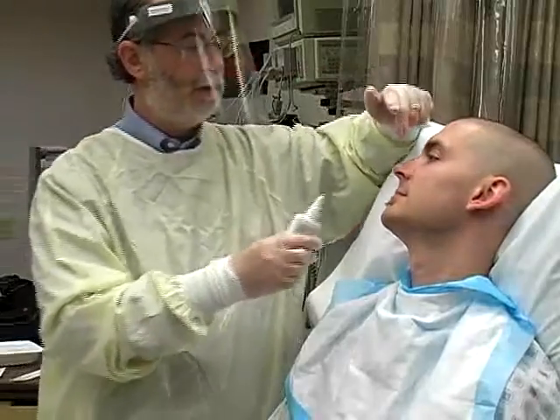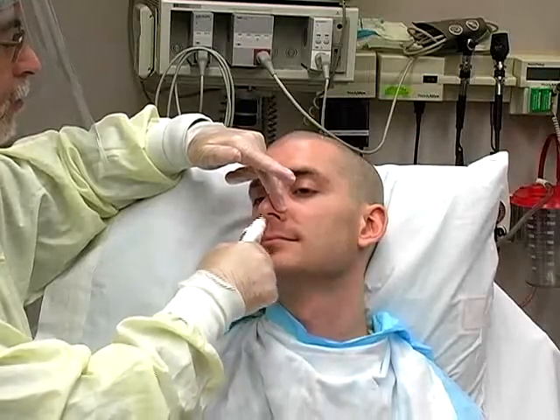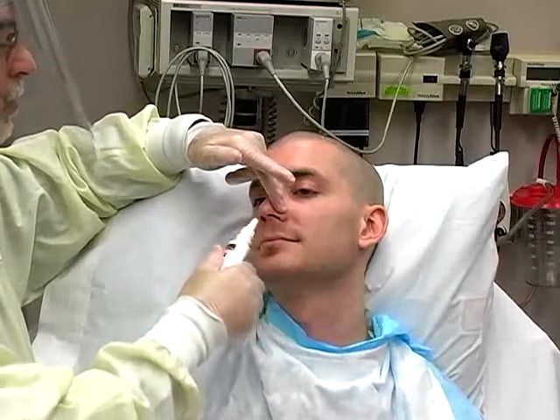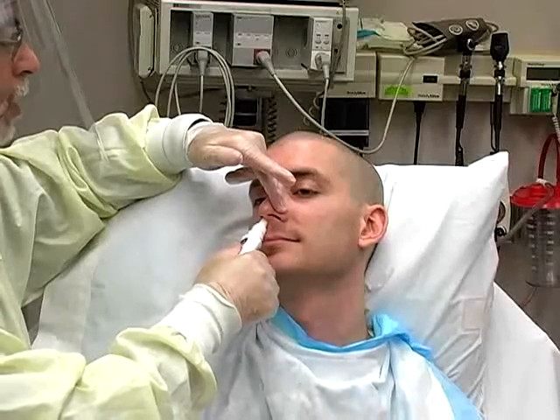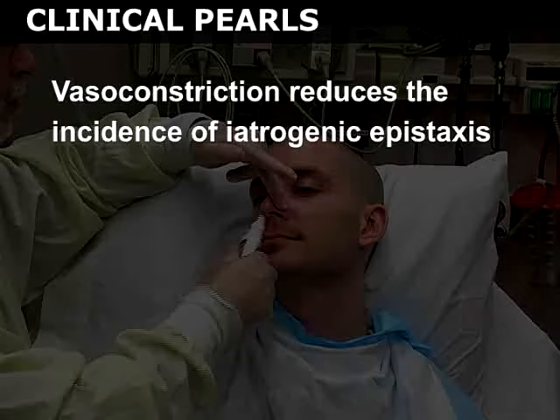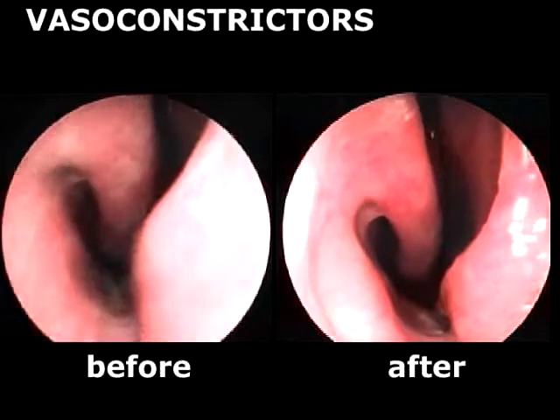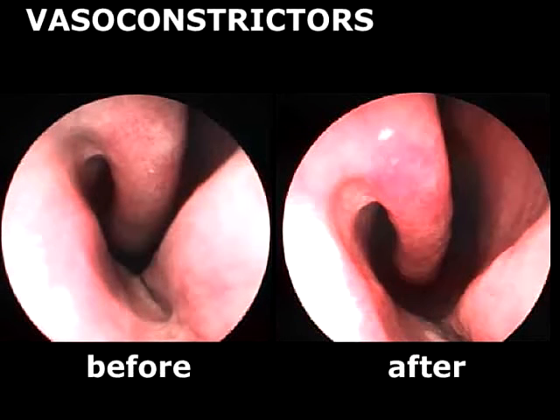Next, begin to prepare the nasal and oral mucosa. First, apply a vasoconstricting agent, such as oxymetazoline or phenylephrine, to the nasal mucosa. This often overlooked step not only reduces the incidence of iatrogenic epistaxis, but also increases the caliber of the nasal canal, which greatly facilitates tube insertion. In these endoscopic views of the nose, note that the administration of a vasoconstrictor shrinks the mucosa and creates a larger conduit for tube advancement.